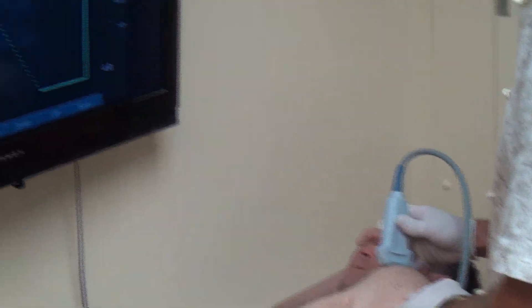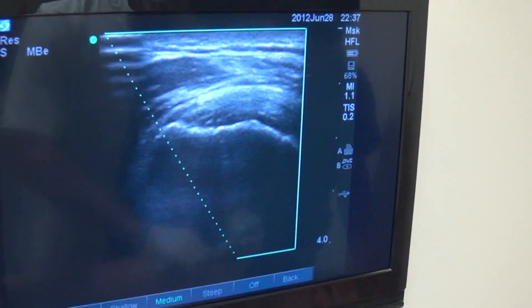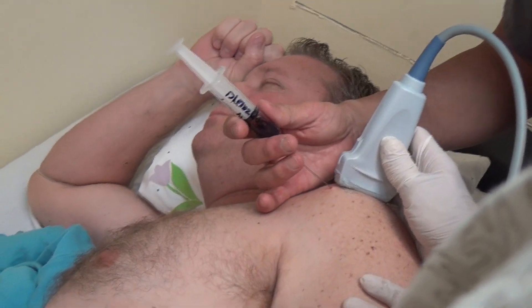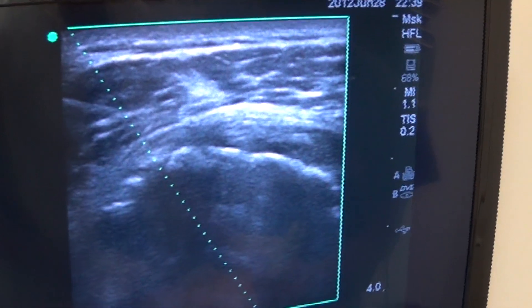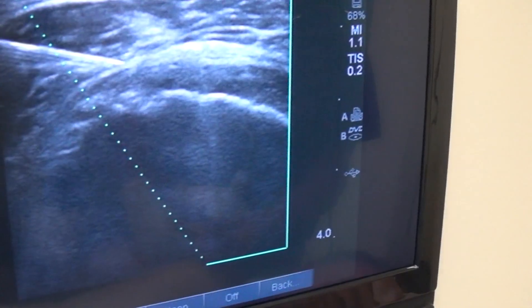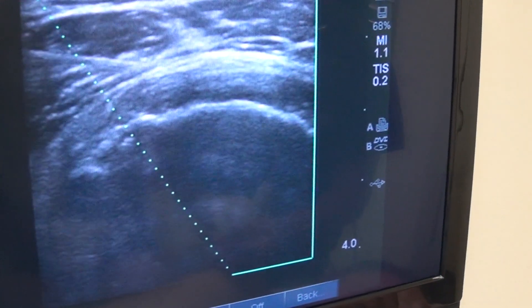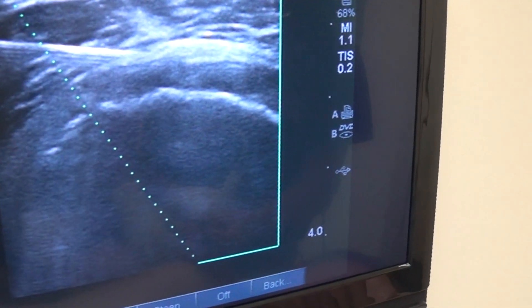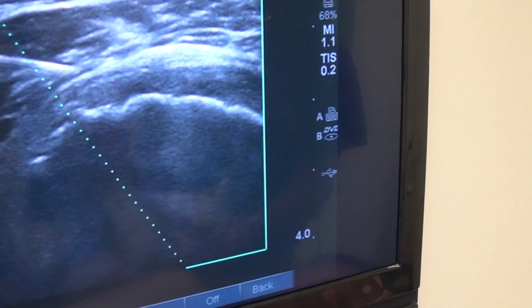The next injection we're going to be doing is the supraspinatus, or the rotator cuff, which I'm pointing out. It's clear on the ultrasound that there's a tear there. Here we're taking a medial approach to the specific location where the tear is, and there you can see the needle on the left-hand side of the screen. There's an even more clear picture of the needle tip going into the rotator cuff supraspinatus attachment where there are tears.